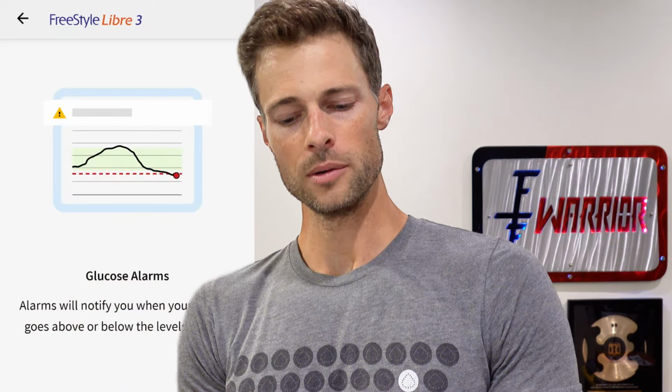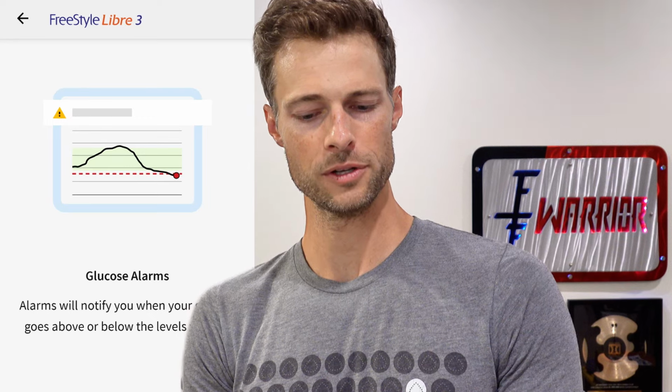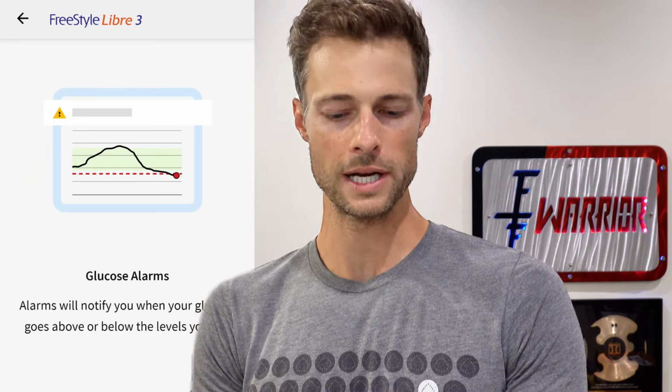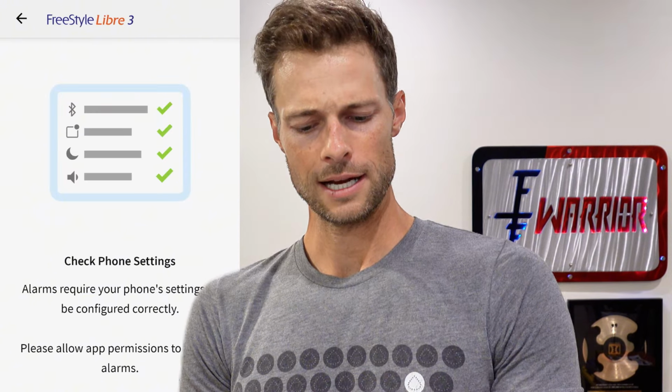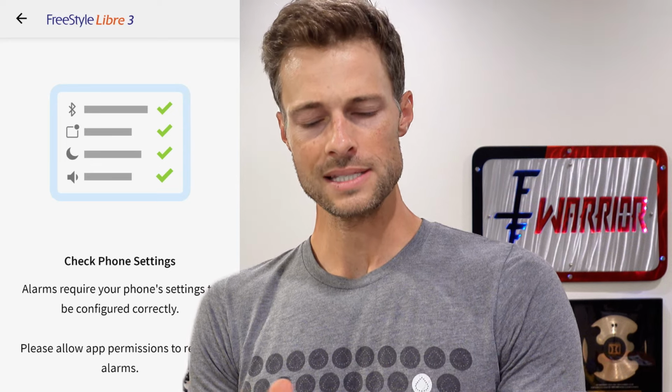All right, we got glucose alarms. Alarms will notify when your glucose goes above or below the levels you set. We know that. Check your audio, blah, blah, blah. Okay, there's just a lot of things that they're walking us through. Check phone settings. I'm gonna put all these on the video because this is taking too long. I gotta get back to my daughter. Allow Bluetooth, yes. Stop optimizing battery usage. Yes, that's fine. Do not disturb, override. Yes, that's fine, right? We're basically saying this CGM has the power to do whatever it wants because we want it to notify us if we have some scary blood sugars, right? If I were to have an urgent low or if there was a high that needs my attention.